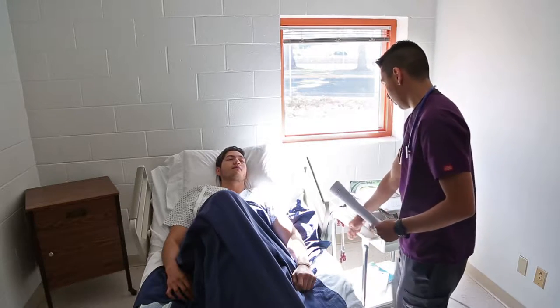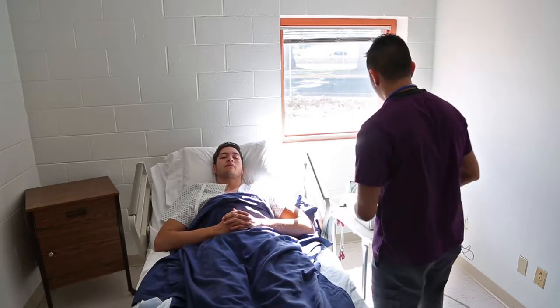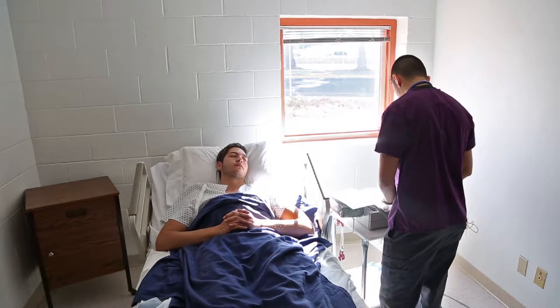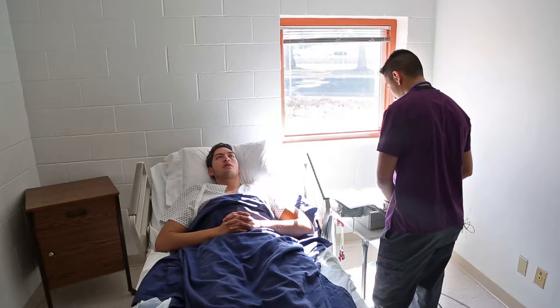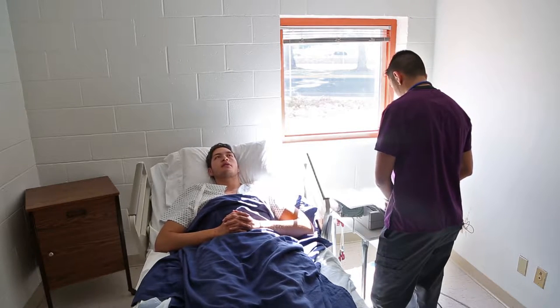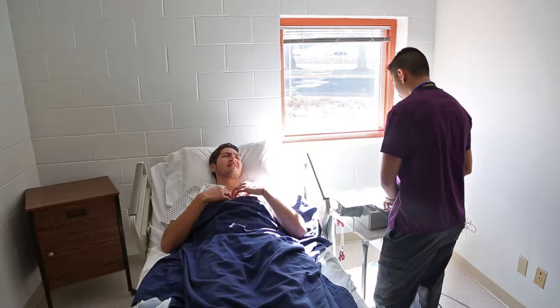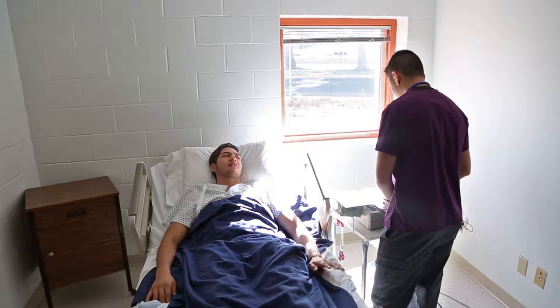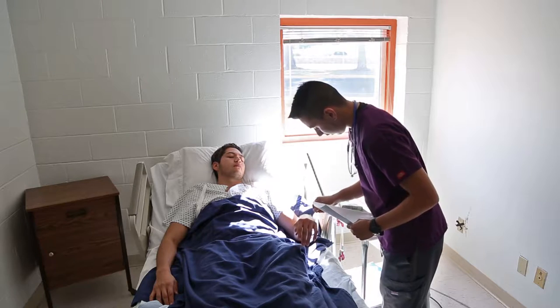We're going to go ahead and get this started. I'm going to be raising the bed, okay? Then I'm going to enter all the information into the machine. Can I get your first name one more time? Ricardo. And your last name? Marcus. And your date of birth? 05-21-84. Are you on any medications? No. And what is the reason you're here visiting us today? I was running and I got a lot of tension in my heart. I feel really dizzy. On a scale of one to ten, what pain were you feeling? It was a seven — I'm at about a five now. I'm going to check your ID to make sure you're the correct patient.